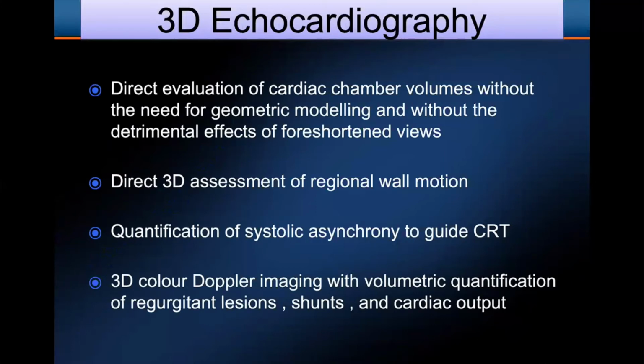With direct 3D assessment of regional wall motion analysis, we could quantify systolic asynchrony to guide CRT in the left ventricle, and 3D color Doppler imaging with volumetric quantification of regurgitant lesions, shunts, and cardiac output.